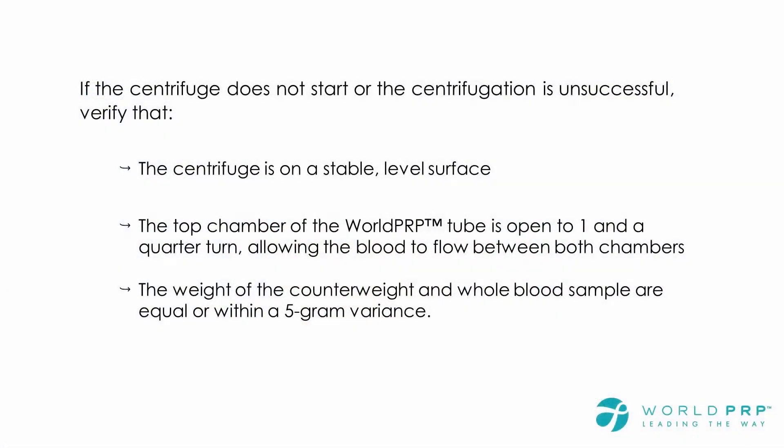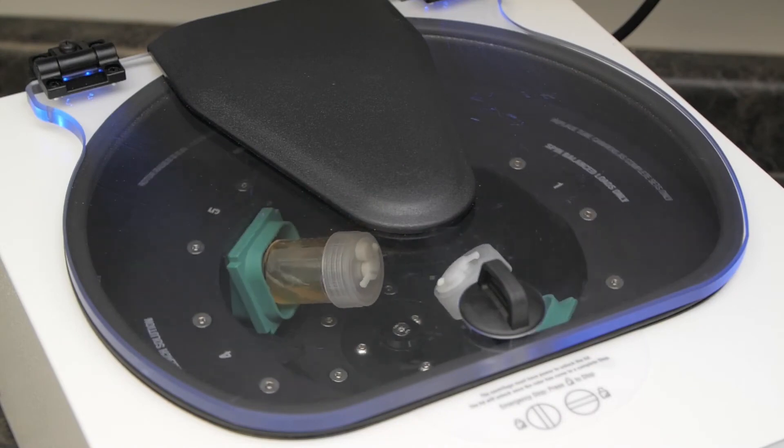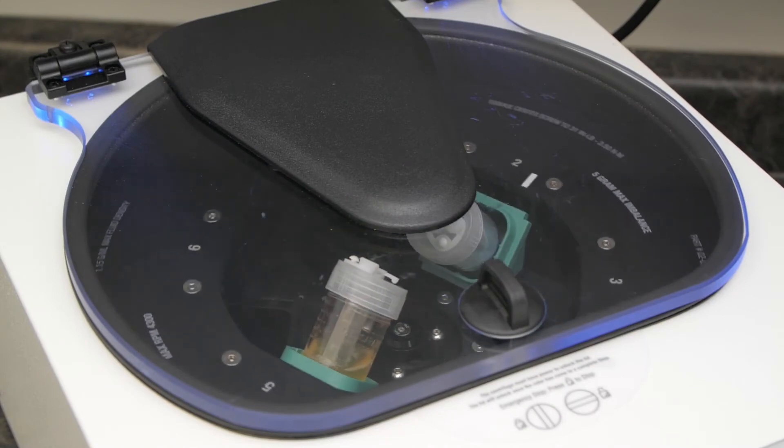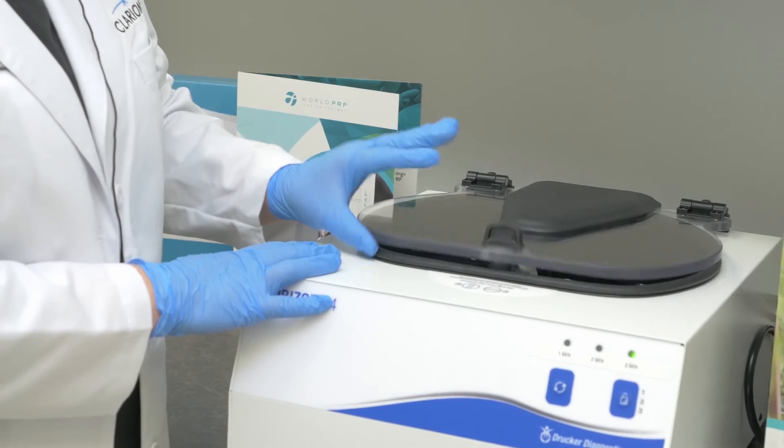If the centrifuge spin cycle is incomplete verify that: 1, the centrifuge is on a stable level surface. 2, the top chamber of the World PRP tube is open to one and a quarter turns allowing the blood to flow between both chambers. 3, the weight of the counterweight and whole blood sample are equal within a 5 gram variance. Once the cycle has stopped unlock the lid and slowly remove the World PRP tube.